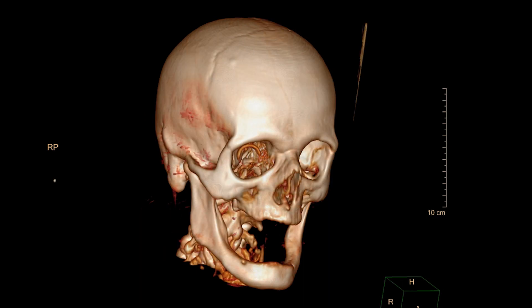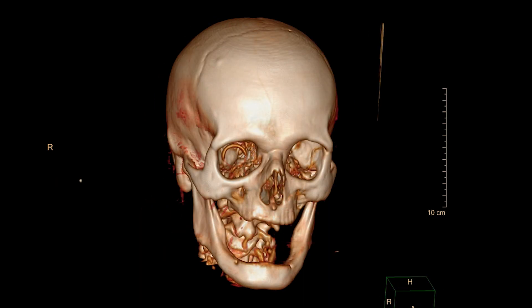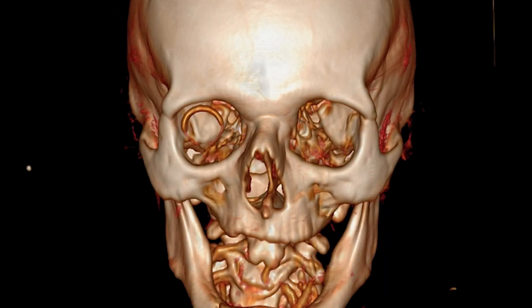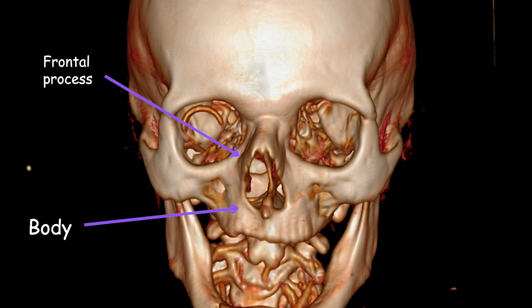The maxilla bone, the largest bone of the face, is a paired bone located in the upper jaw. It contributes to the structure of the face, particularly the central region. The maxillary bone consists of several parts, including the body, frontal process, zygomatic process, palatine process, alveolar process, and sinus.